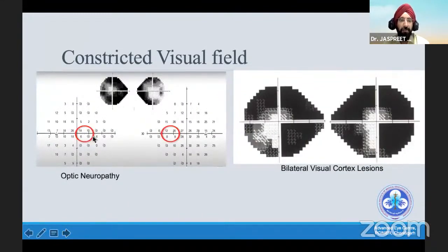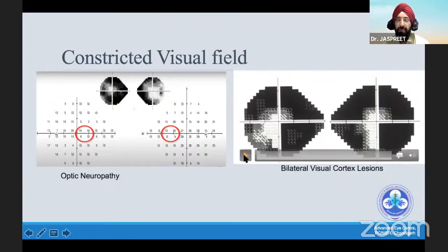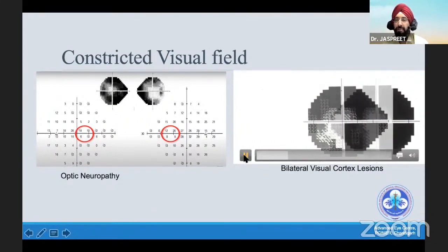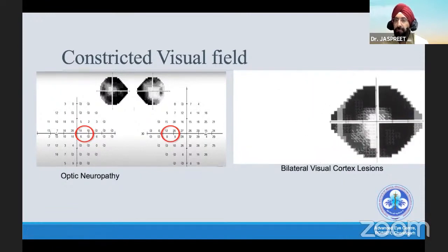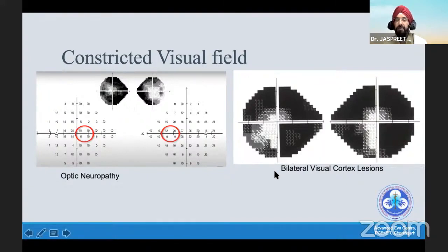Constricted visual fields were discussed and also seen in optic neuropathy, with a difference in threshold sensitivity in the nasal area evident on the deviation plot — basically a double arcuate scotoma going above and below. If you have a lesion in the bilateral visual cortex, a clue is that it's a bilateral homonymous hemianopia where the images are superimposable. The second clue is a difference in vertical threshold sensitivity — if you see a dark area on one side versus lighter on the other, that gives a clue that something is going on in the visual cortex.